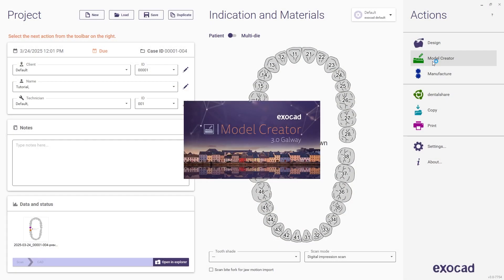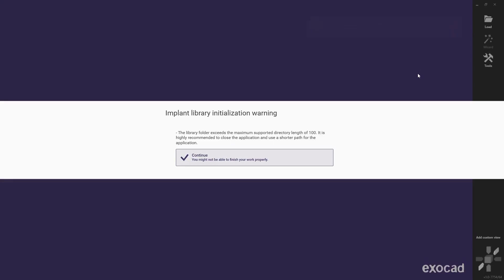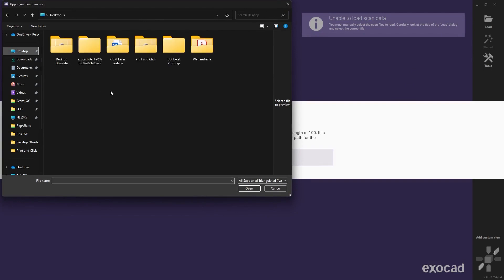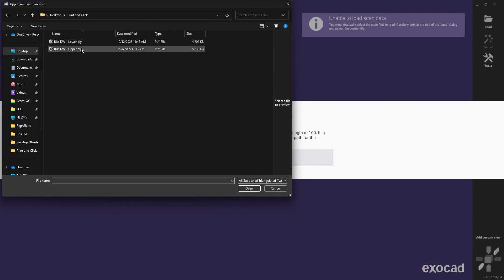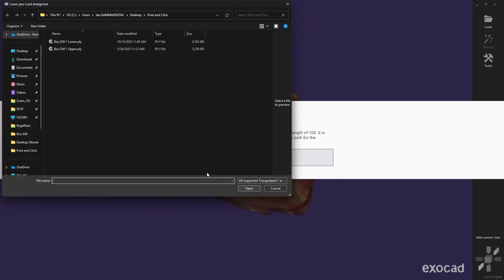The first step is making a printable model from the 3D scans made with your intraoral scanner. This step is currently not possible in Cadius 3D. Instead, we use Model Creator from Exocad, but you can also use other tools like the Model Builder from 3Shape or Medit.